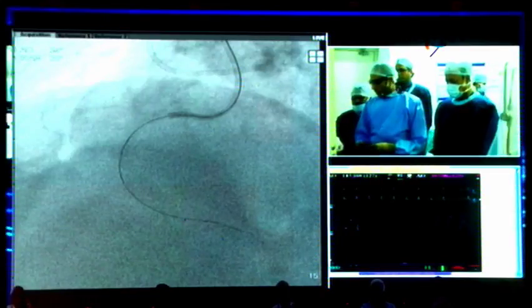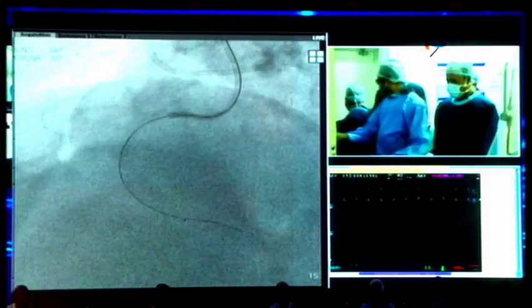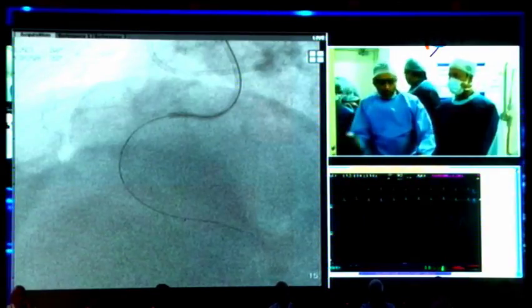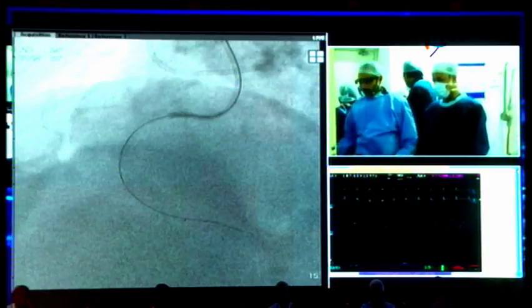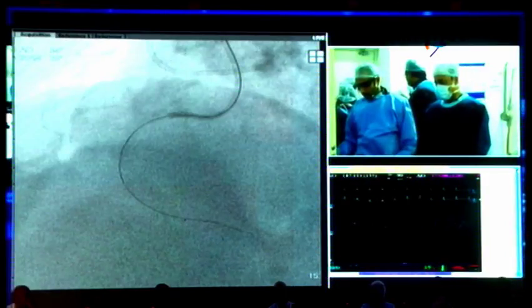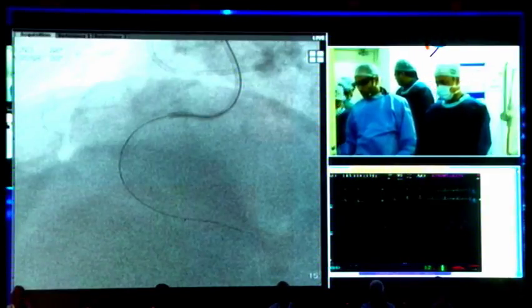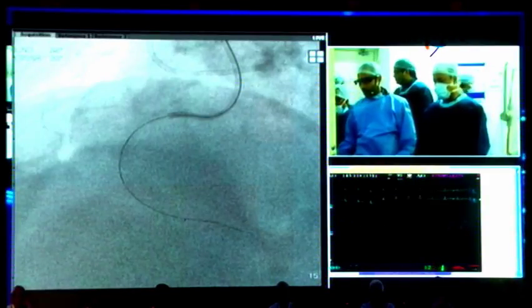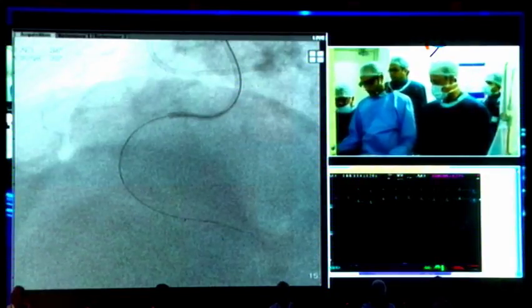No, I want the Prograph, not this. The other one. Is it called Prograde or whatever? Okay, sorry, guys. It's Prograde. I've never used that. The profile of a Prograde is not good. Generally, it is used for peripheral cases. I understand, that's what I was told. It's used for neuro stuff, but we don't have anything else. The tip is very soft and mostly used in neuro here.